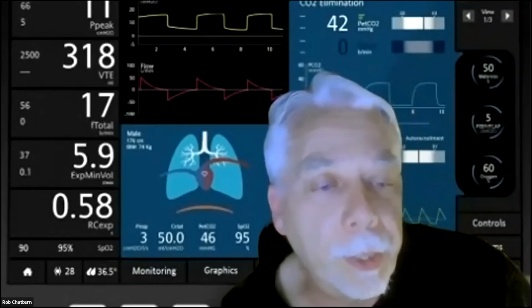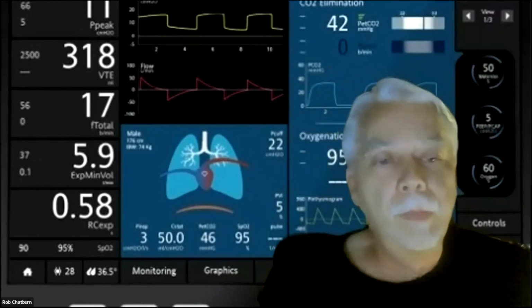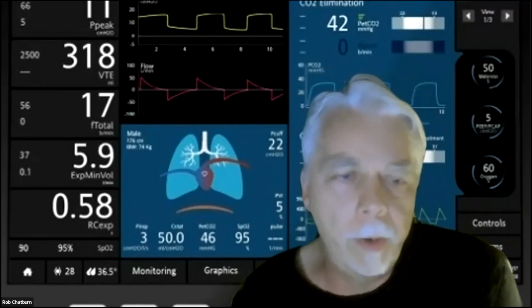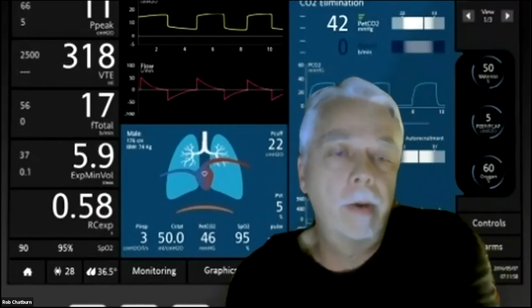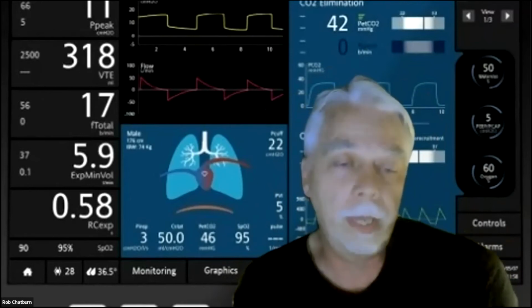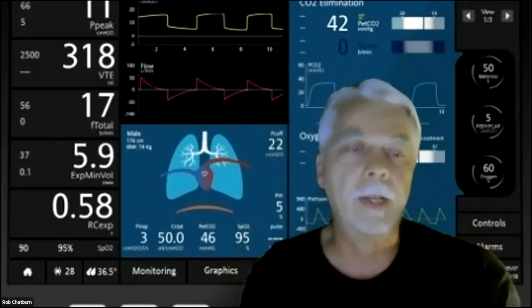That's why ventilators can go up to 150 breaths per minute, because you can do that on a neonate. Yeah. We actually had one human study on neonates of mid-frequency ventilation, and they pushed the rate up to 100, 150, and it worked. And you can get away with that because they have such a very short time constant.